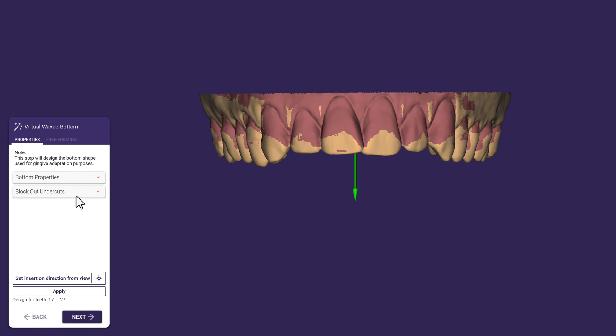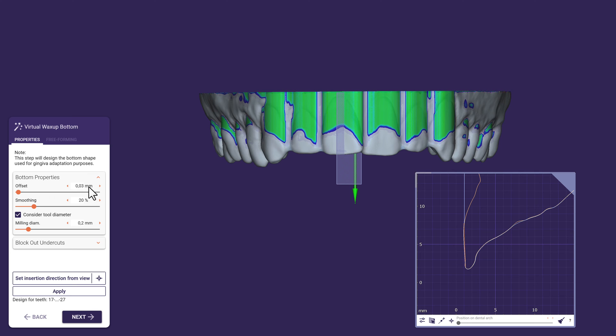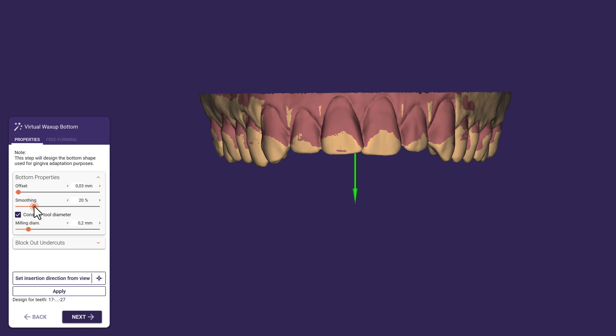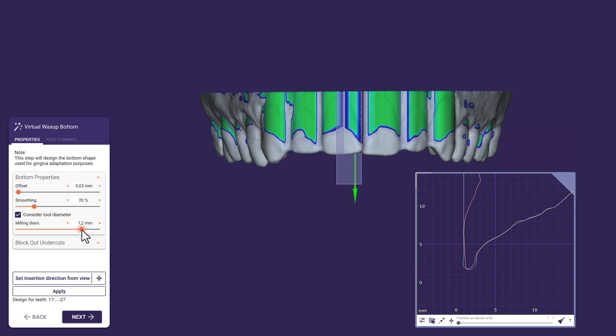Let's have a closer look at DentalCAD in the Virtual Waxer bottom step. Offset controls the digital spacer laid on the model — in this case 30 microns. Smoothing will add more blocked-out material into concavities; the larger the number, the smoother it will be. Consider tool diameter: this value affects the space around sharp incisal edges and depends on your specific manufacturing process. For a CNC machine, the ideal parameter for milling depends on the size of the smallest burr used. It's beneficial to choose a value slightly higher than the actual tool diameter — for example, choose 1.2 mm when milling with a 1 mm tool to ensure a perfect fit without losing too much space. If a 3D printer is doing the job instead, this value should be reduced to 0.1 mm.